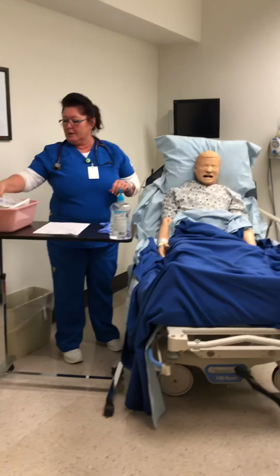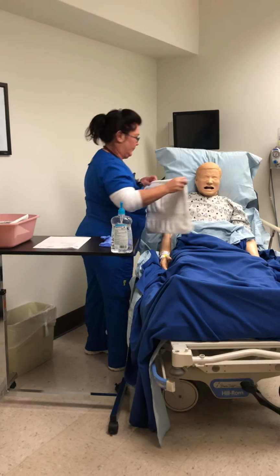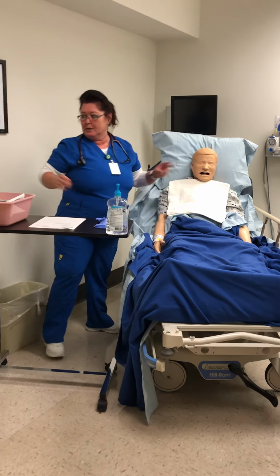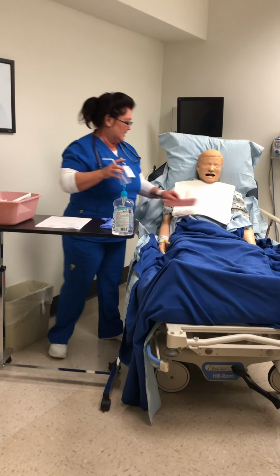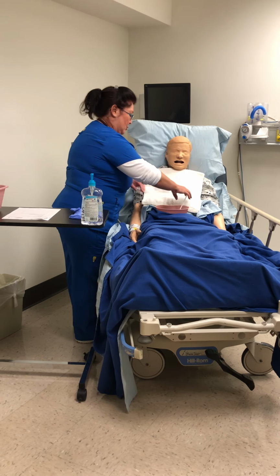And I am going to place a towel over her. This will protect her from any fluids that come out through her mouth or whatnot. I have her emesis basin. I have a cup of water, or ice water with a straw.